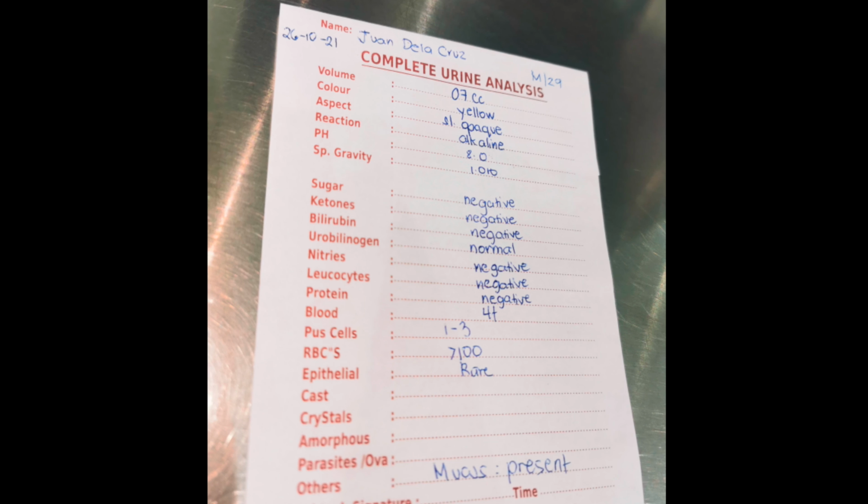This is the result of the patient's complete urinalysis. The microscopic reading of blood is more than 100 per high-power field. Pus cells are 1 to 3. Epithelial cells are rare. Mucus is present.